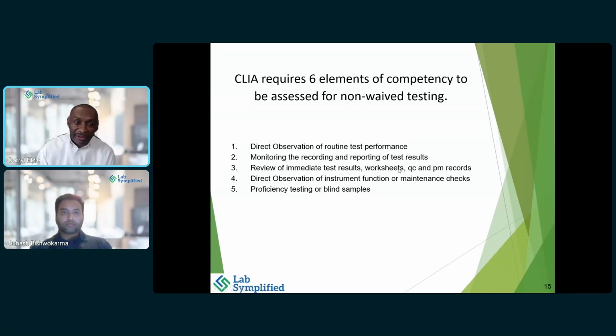You cannot just give them a previous analyzed sample and have them run it and just throw that in the packet or however you keep your record keeping. You need to evaluate that. What many places do, they use plus or minus of the PT, whether it's a CAP or API or Wisconsin or whoever you use, whatever that's SD, and say, well, it needs to be this close, and you need to have on that evaluation that it is acceptable. Do the whole thing on those blind samples.